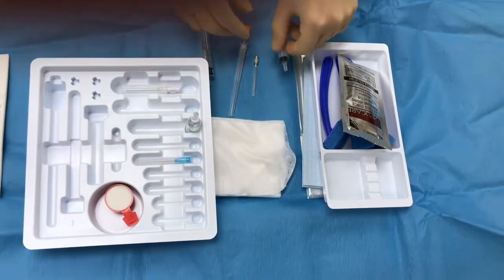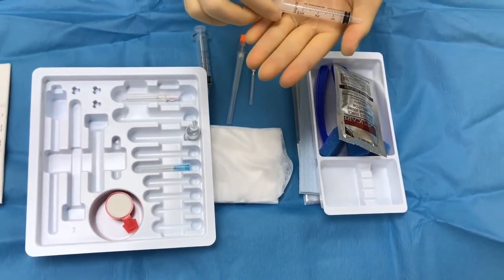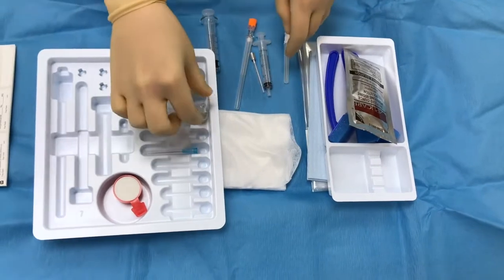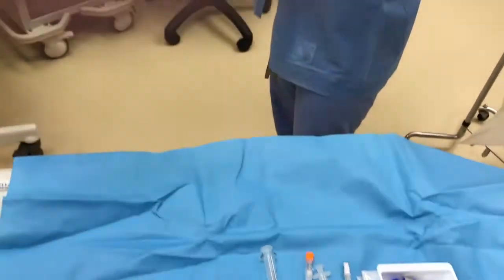Okay, so starting from the top, personally I grab this 3 cc syringe for our topical. You're going to use your filter needle to draw up your lidocaine. Here's your 1% lidocaine. Again, open the lidocaine away from the field to avoid any glass shards.